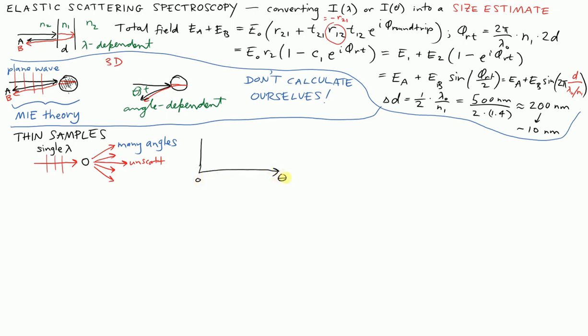where if the x-axis is scattering polar angle, there's going to be some theta minimum that your measurement starts at, because you can't really measure anything at 0 degrees. And then you get some signal pattern like this. It won't always have ripples like that, but I'm just drawing that for an example. So this is what your data look like. This is intensity as a function of theta.